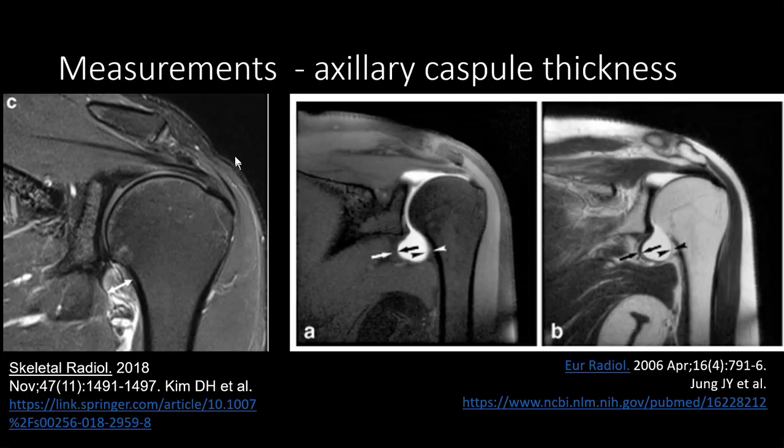You have to be careful when measuring the axillary capsule thickness because there are two ways to measure it. Some use both parts of the recess together, as in a 2018 publication, while others use just one side. Typically the cutoff value is three to four millimeters, and if higher it may be consistent with frozen shoulder.